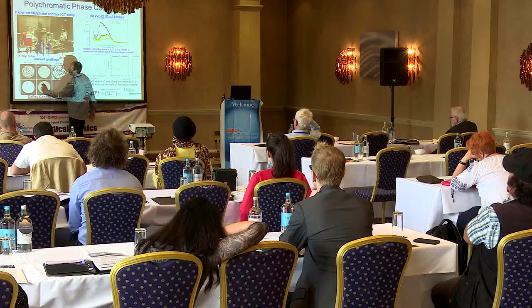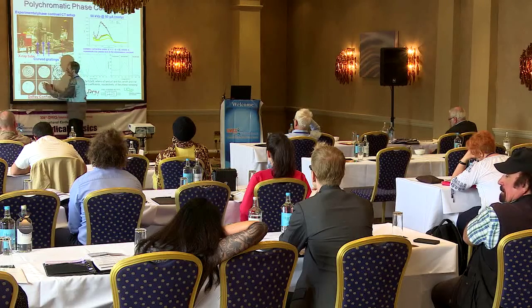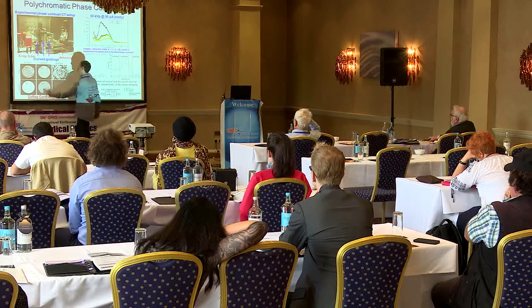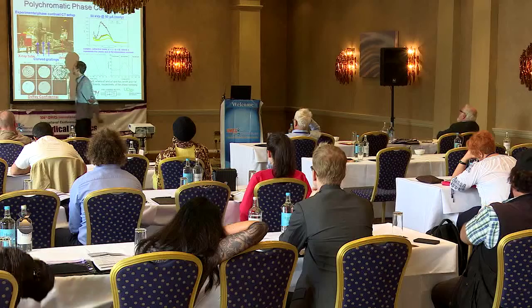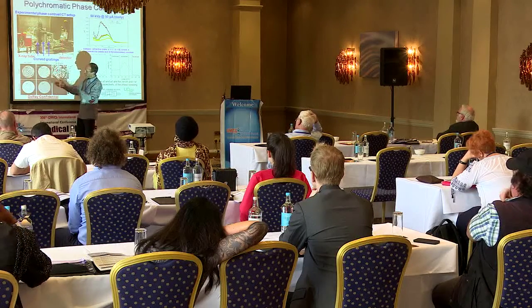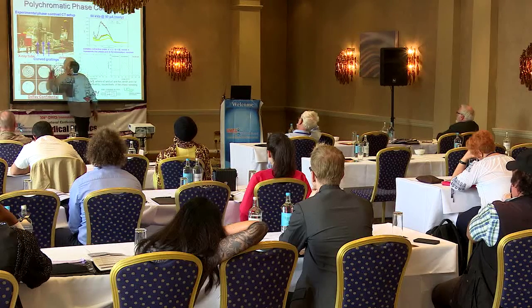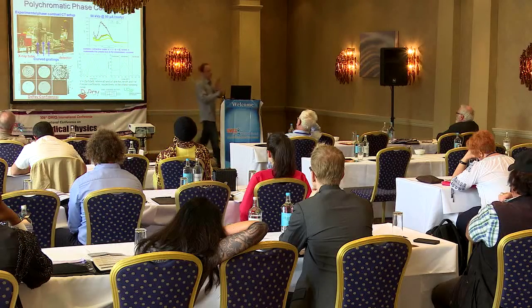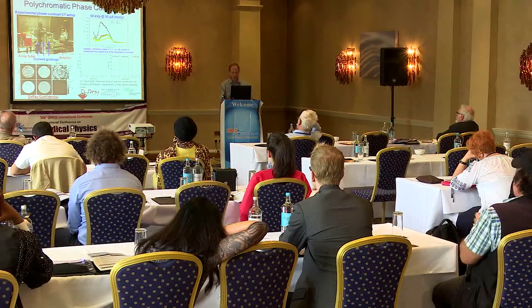These two holes in this rod phantom were plugged with wax at either end so that no water would go in, and also here in two places over here, smaller holes. But in the phase contrast, where we detect the index of refraction of the material across the entire object, you can see that we get and can resolve these two objects.